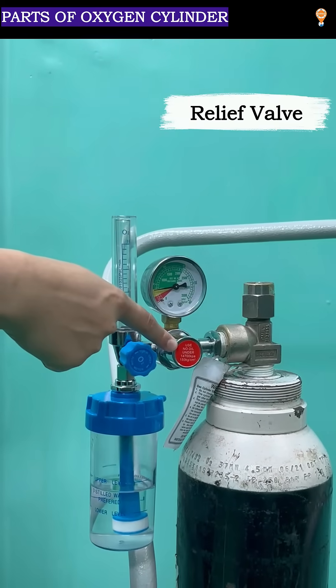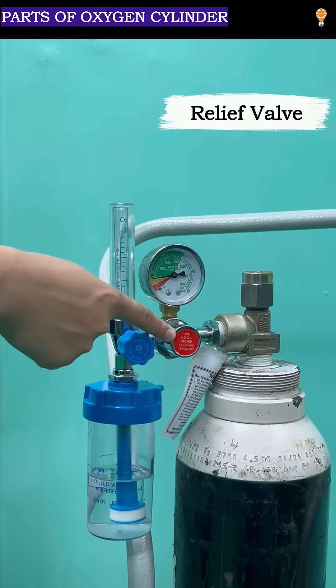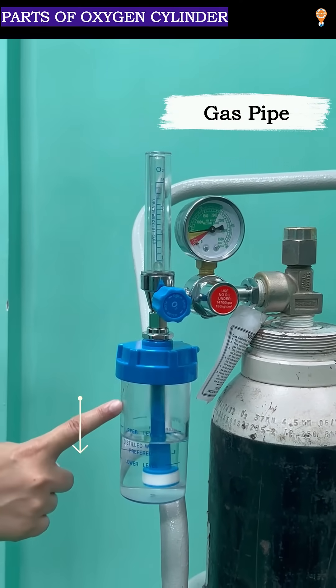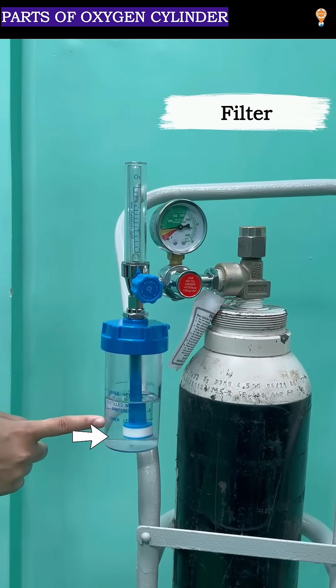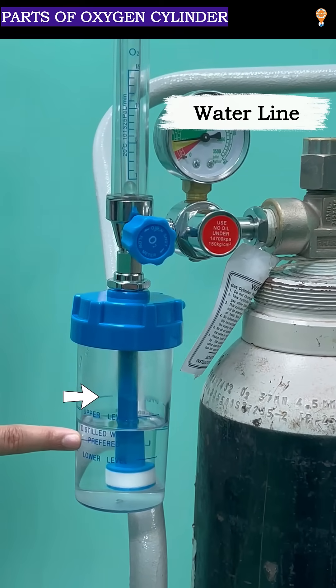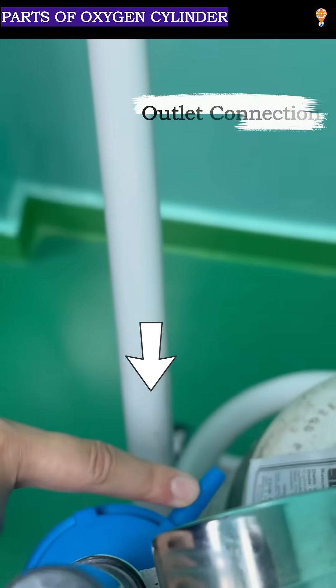Relief valve, where the pressure reducing plunger system is present. Gas pipe. Filter. Water line. Outlet connection.